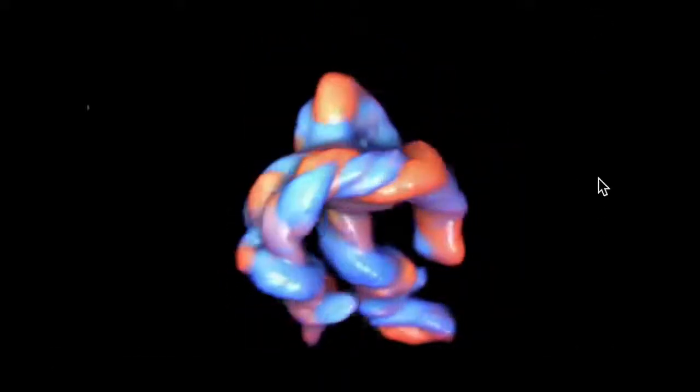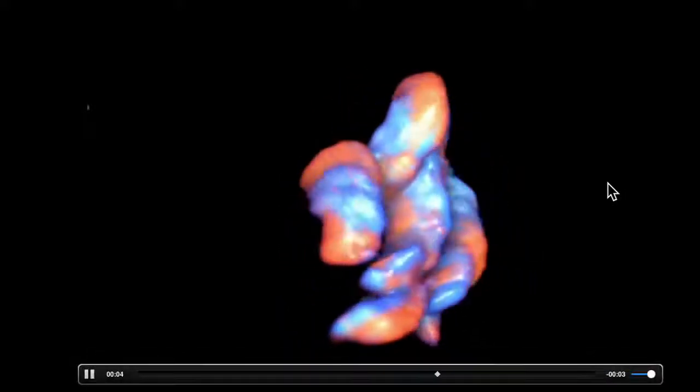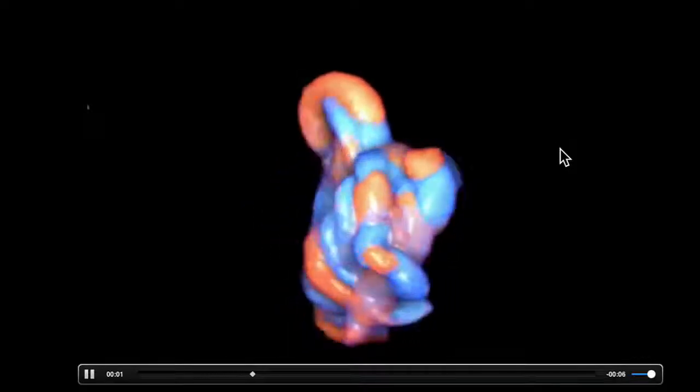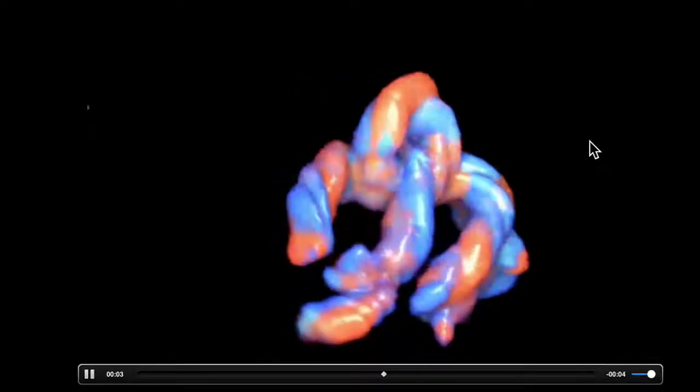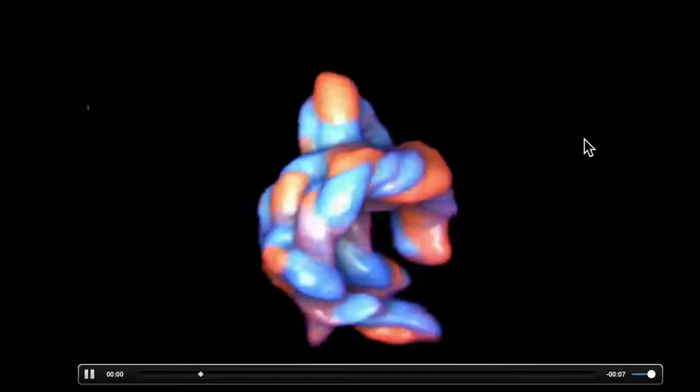See, here's the example of the VSD we just saw, and you can kind of scope out that it's mid-muscular by looking at just the vessel renderings, but not as good an idea of where it is in space without the glass body. Here's just a 3D static model of a really abnormally knotted umbilical cord. The two holes that you see right here basically represent where the fetal legs were. So this is a tight knotted cord around the fetal extremities due to amniotic bands.